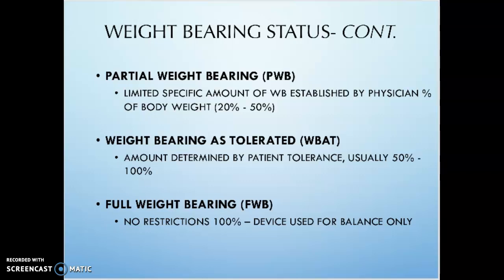The doctor may indicate 20% or 50% weight bearing, and so in some scenarios, it will actually go to the point of using a bathroom scale to instruct our patient what 20% means or what 50% feels like.